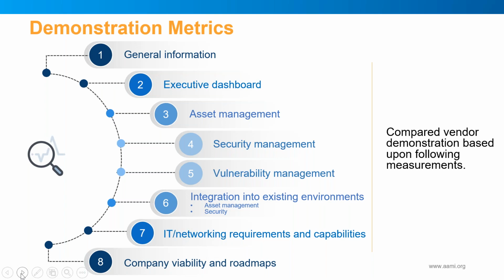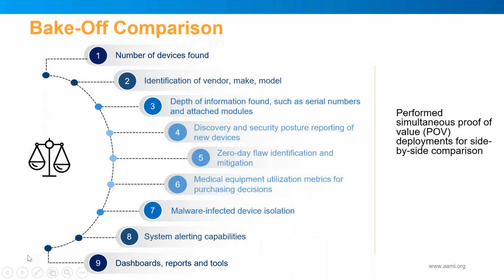They've been doing it with their computer devices and IT devices. So working between the CE departments and your IT department is essential in this. And we probably could have saved ourselves a couple of months on our initial project if we would have partnered with them earlier on. So that's very important.